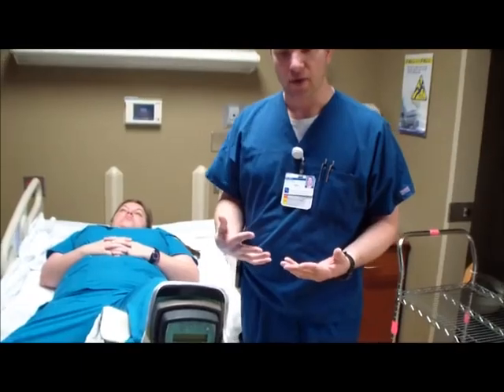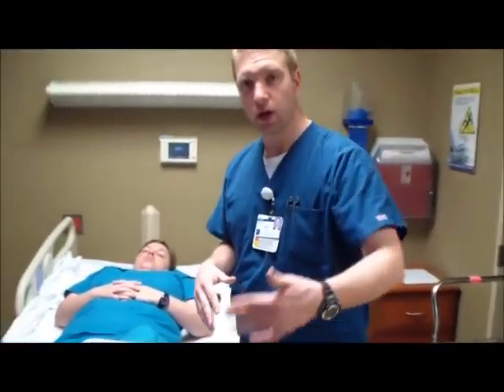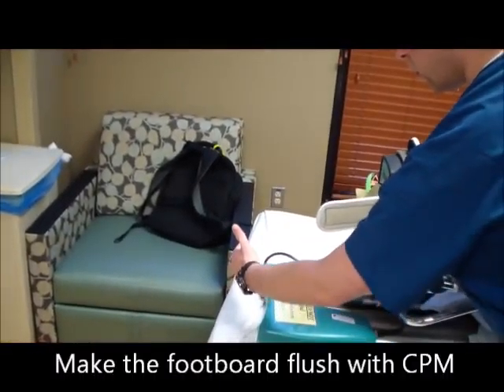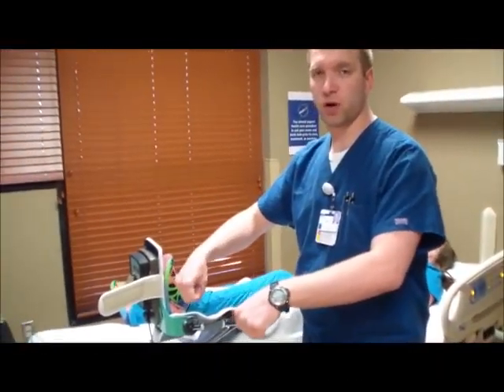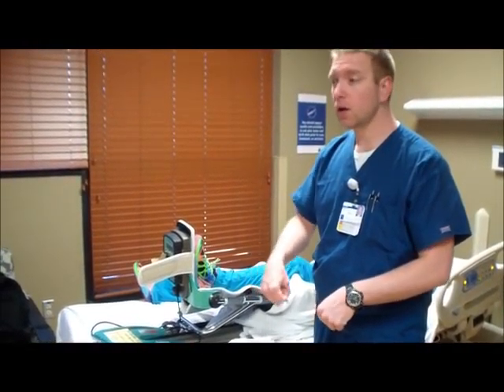Normally when you have a regular floor bed, you're going to have a baseboard, and you're going to want to bring the baseboard close enough where it butts up against the end of this. If it's difficult, sometimes you can take the baseboard off, but you need to leave some room to put the baseboard back on.